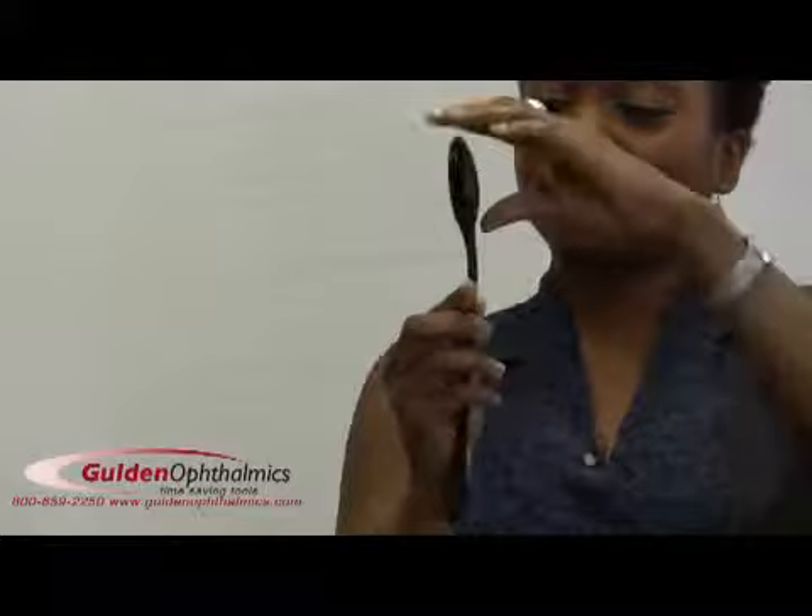In fact, practitioners have been telling us for years that our occluders are made so well that they do not break. Apparently, they are right. Occluders are available in black or white and have a standard length of 25 millimeters.